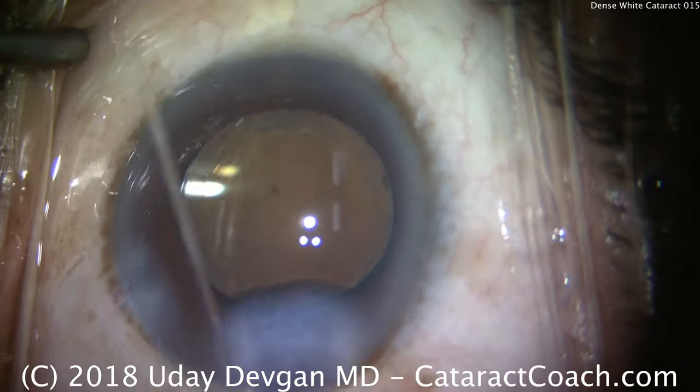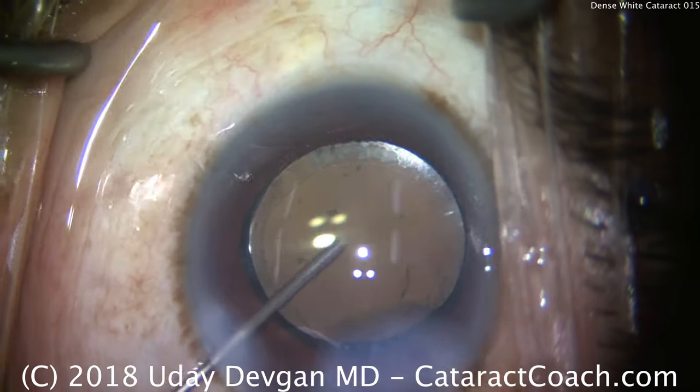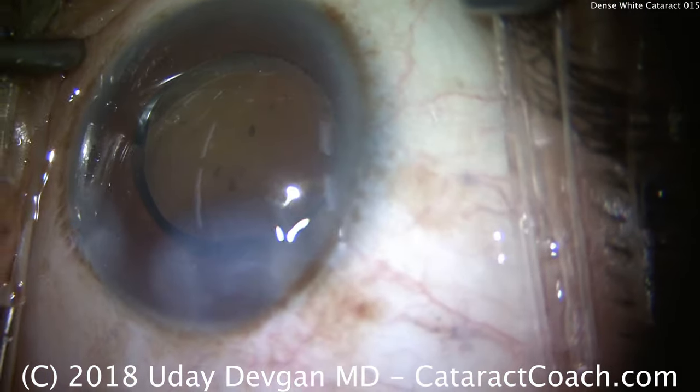So we'll seal up the incisions and we'll call it a day. This patient was absolutely thrilled, and it's such a pleasure to operate on people who have such terrible cataracts.